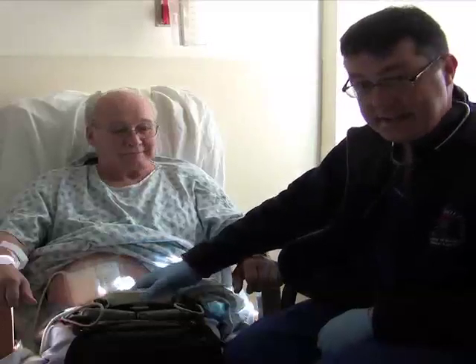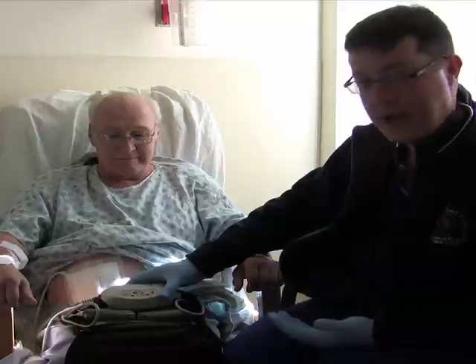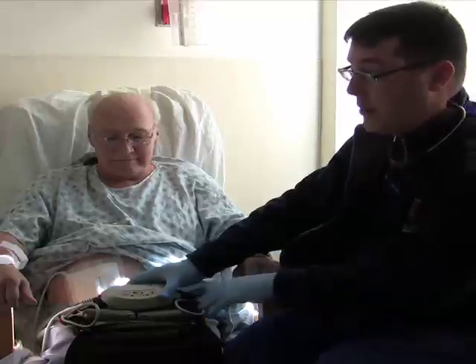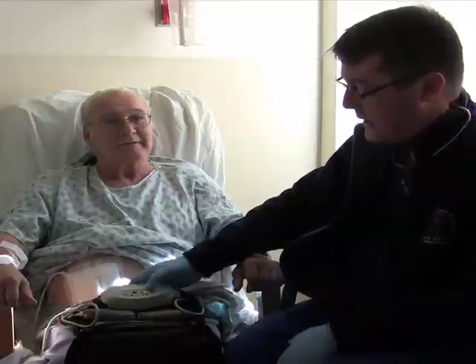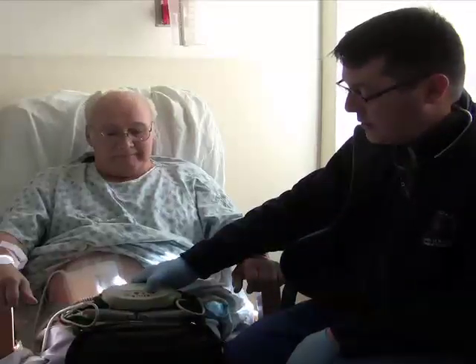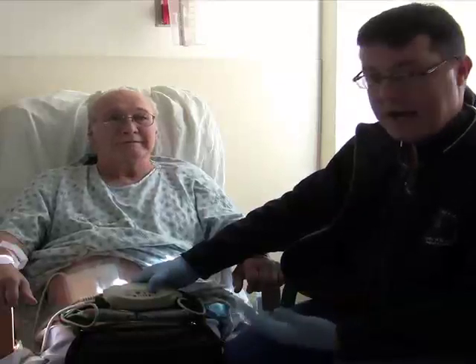And then lastly is the equipment. The equipment should be normally operating if plugged into either the power of the batteries or the AC adapter wall unit through the power module. And the most important finding is that the green light is on, steady, and the controller is not alarming or making any noise.